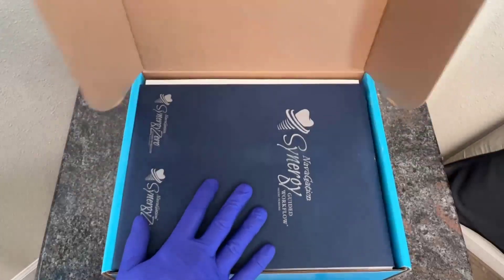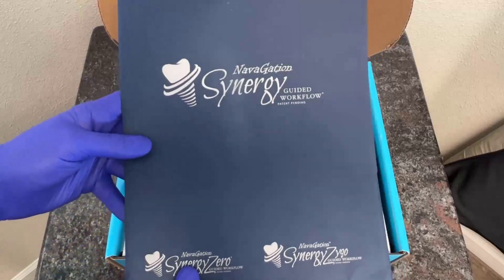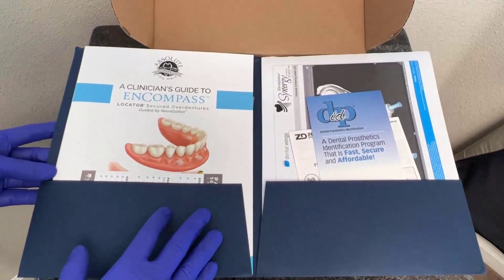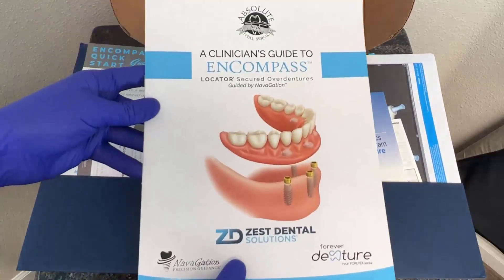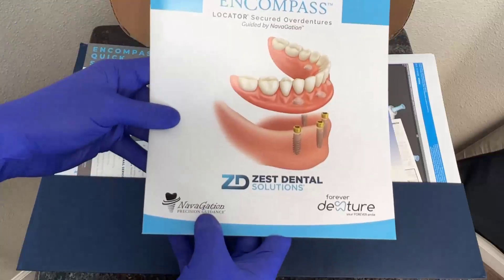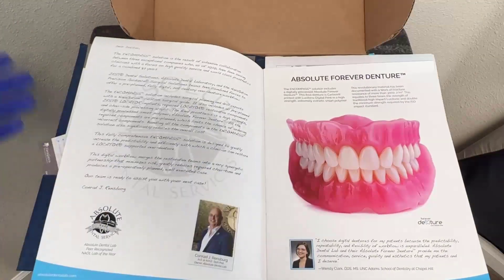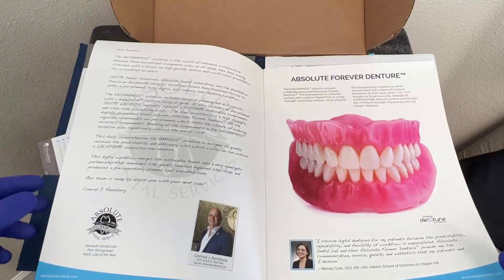As I open up the box to go ahead and take a look inside, I'm instantly greeted by a brochure of information that's going to be related to my patient case. As I open this up, it's going to also have a lot of the basic information associated with the Encompass solution. We can see here that we have a brochure of information that is all about Encompass, put together with the team at Absolute Dental Services, Navigation, and Zest Dental Solutions to create a very premium feel. This informational brochure is already available on the Zest Dental Solutions and Absolute Dental Services website.